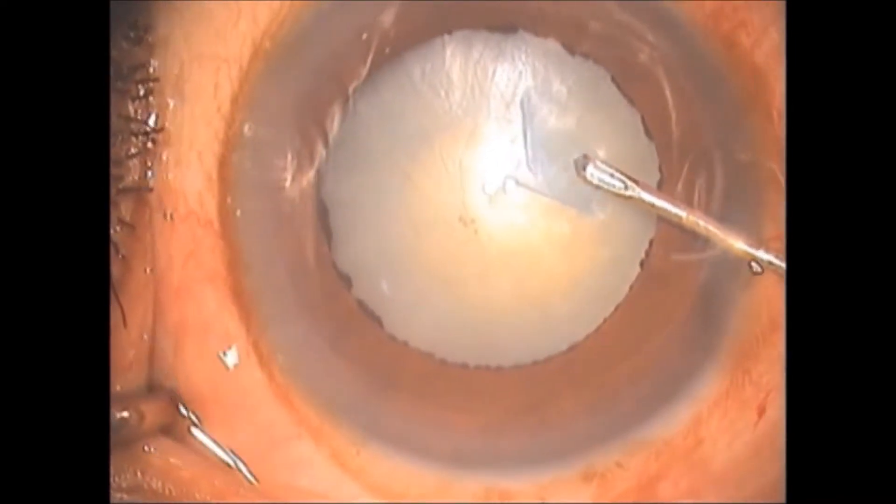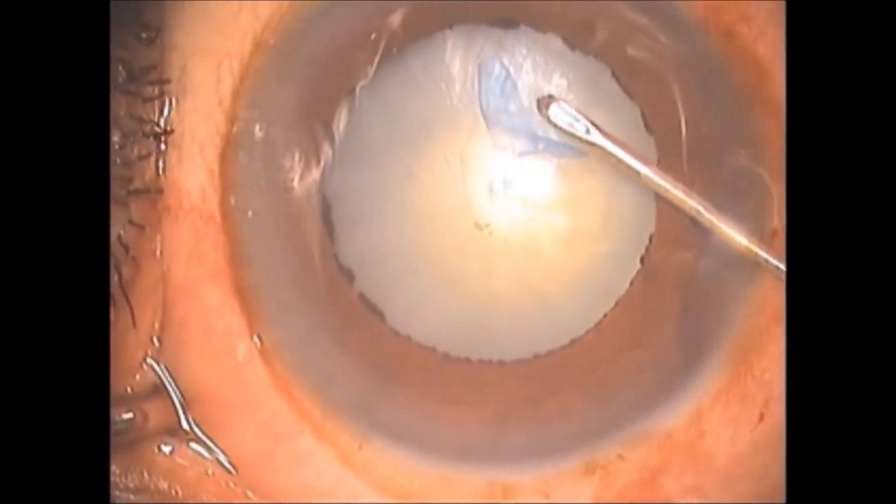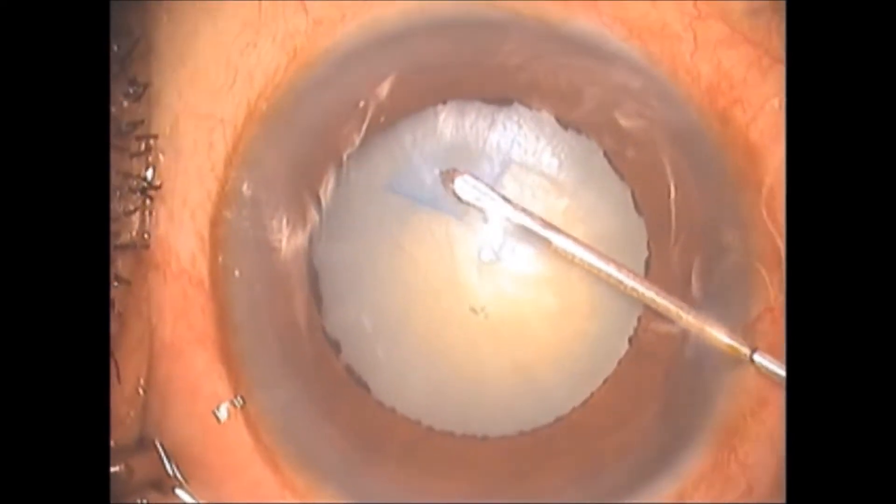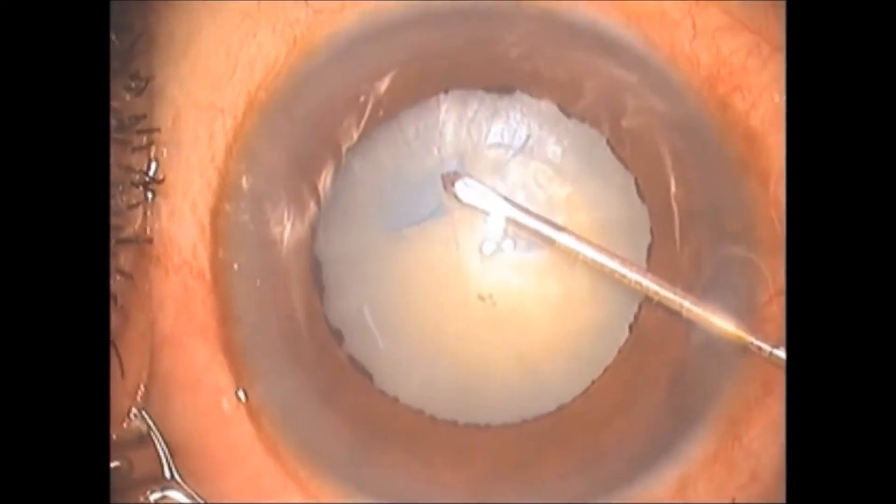As the intralenticular pressure is normal and absence of liquid cortex is present, the surgeon is able to complete the rhexis with a 26-gauge cystotome needle.